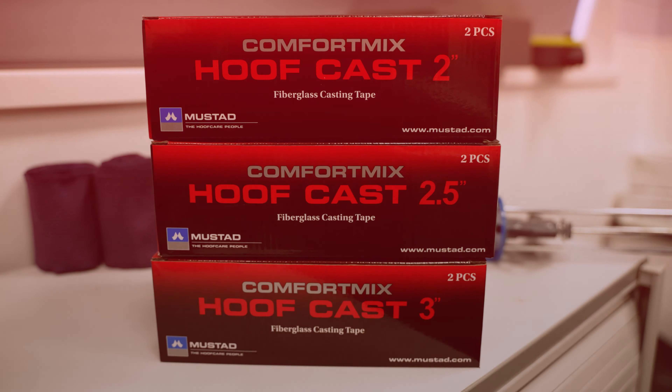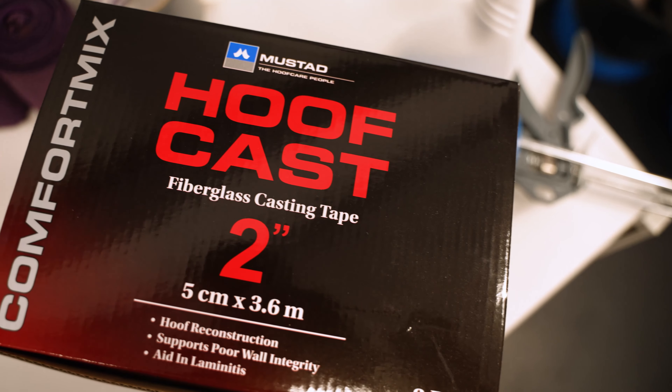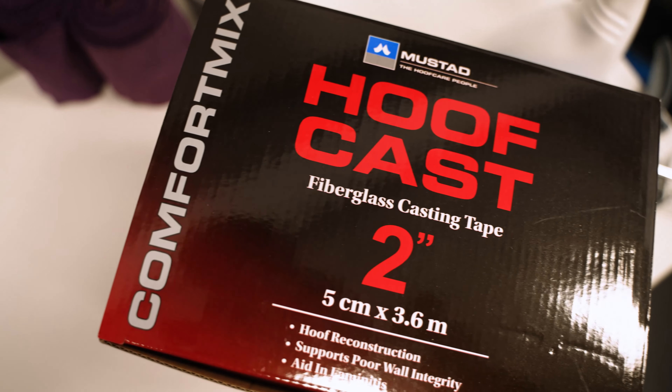The Mustad HoofCast is a fiberglass casting tape for hoof reconstruction, supporting poor wall integrity and also aiding in laminitis.